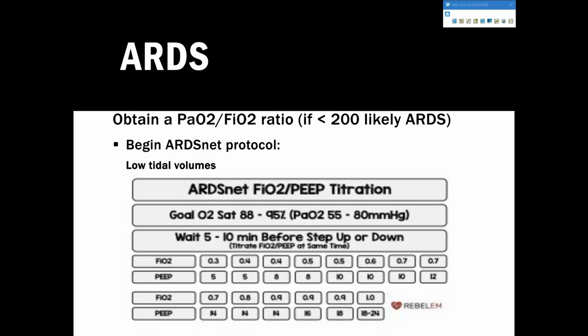Okay, because your FiO2 is most detrimental at this point, because when you have ARDS lungs, you already have that non-homogeneous lung going on. You have areas of overdistension, areas of underdistension, you have the ground glass. So the last thing you want to do is cause more lung injury with the O2 toxicity. Okay, so that's the reason we try to do that.